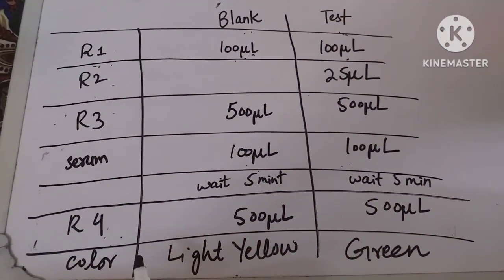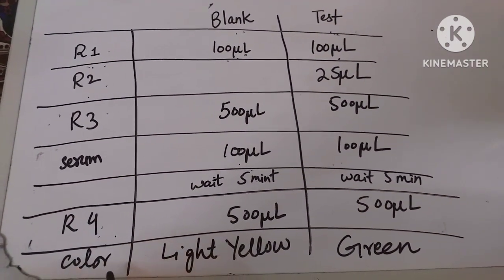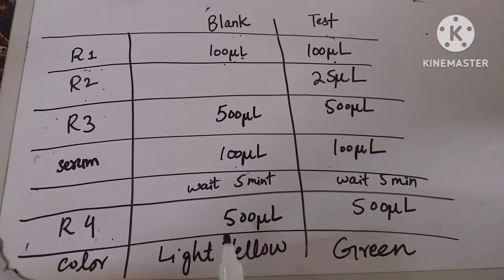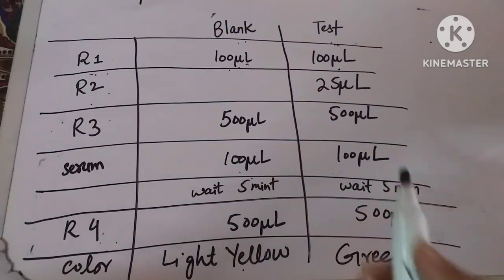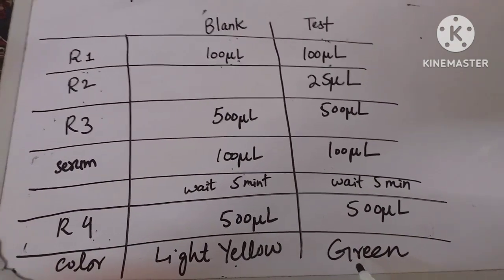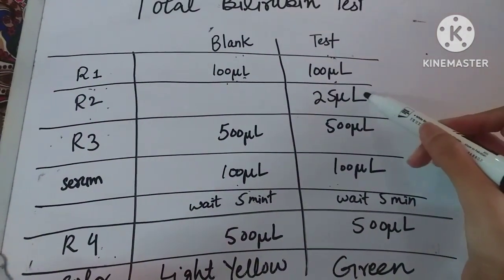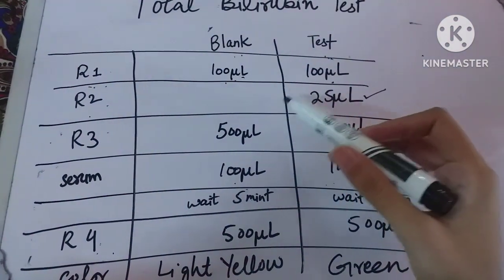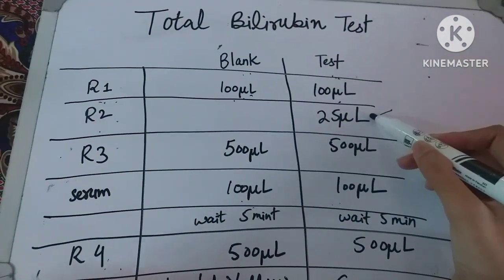After adding R4, the final color appears: the blank test tube color will appear light yellow, and the test tube color will appear green — the one in which we added R2. So the only difference between the blank and test tube is the R2 reagent.